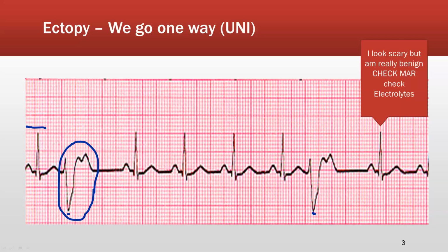I do see that it comes earlier than I would have expected. I would have expected it to come there. And I also have a compensatory pause. Now, the thing that is special about this sinus rhythm, because it is still a sinus rhythm, with a heart rate, I believe, somewhere between 80 and 90, is that we're going to count these extra beats because, again, it's still the ventricles contracting.